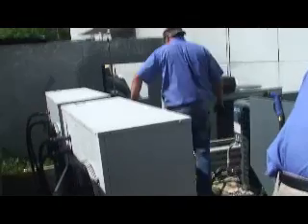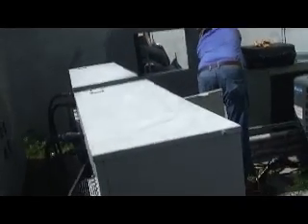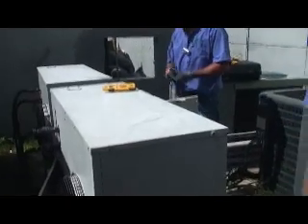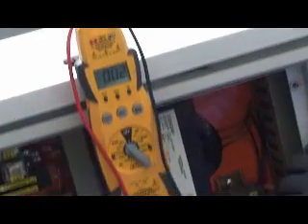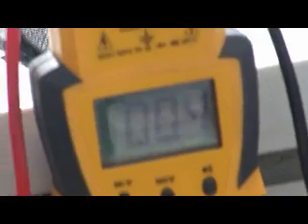I'm gonna go ahead and take my voltages. Volt AC, 600 volts, the highest setting, and I have my power coming in here to the disconnect to take my incoming power. This is 553, 485, 483. Let me take this one again. That one's reading. There we go, 480.